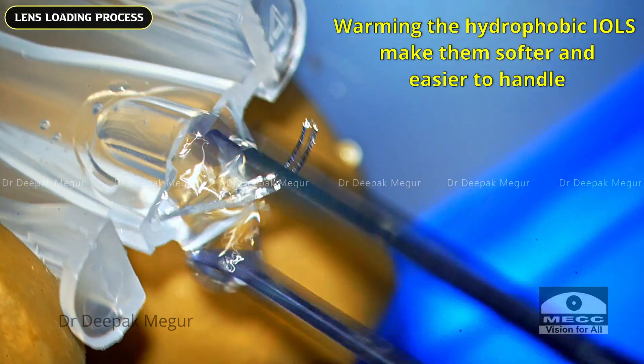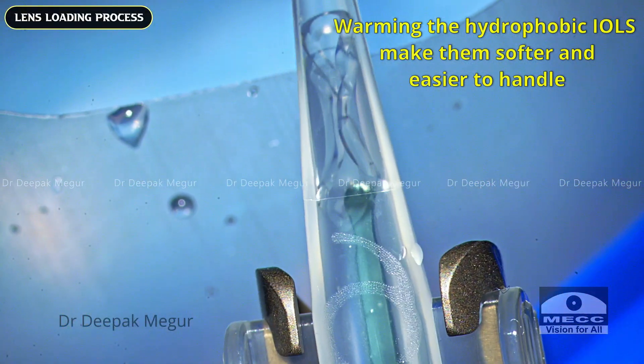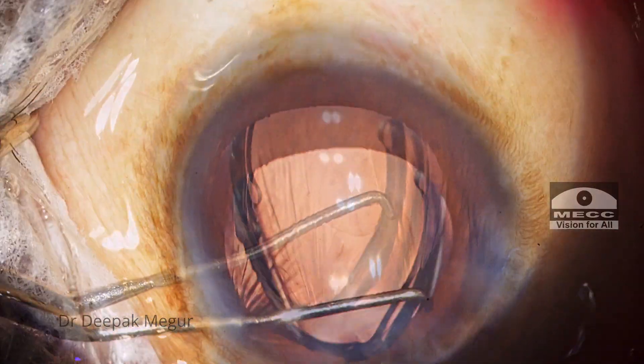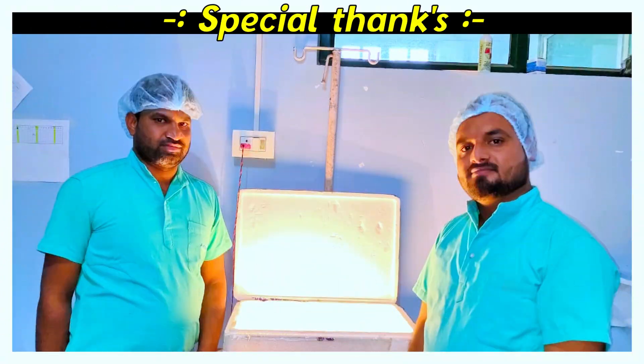The implantation process and even the lens unfolding is quicker, and the haptics don't stick onto the optic for long — which we used to see with unwarmed lenses. So this was a little trick I've been using and it has been very helpful for us.